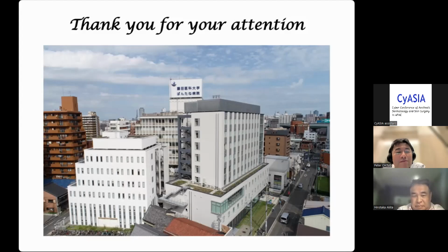So David asks again, improving collagen to lighten melasma. Do you think inducing LIOB using pico fractional helps? That is the reason why I did that study. I did half the face on top of the pico toning. I toned the whole face with pico toning, but on top of that, I used the fractional handpiece on one side to create this LIOB. But somehow it didn't show significant difference compared to the other side.